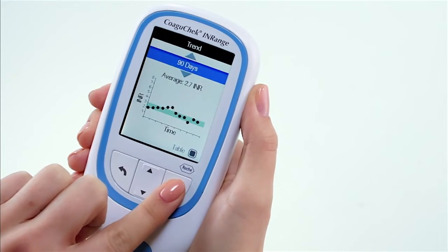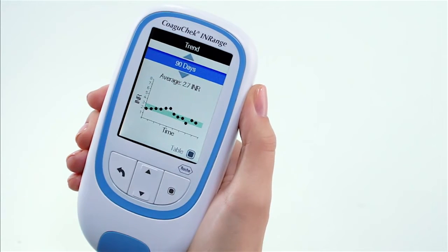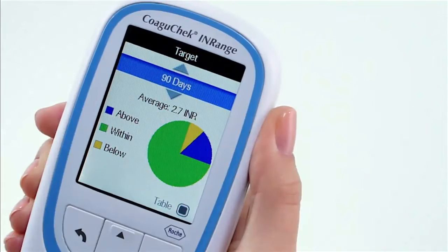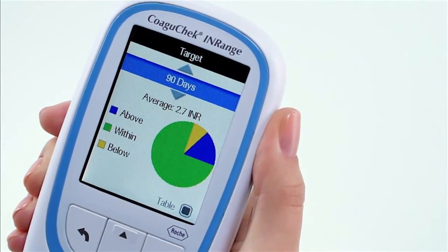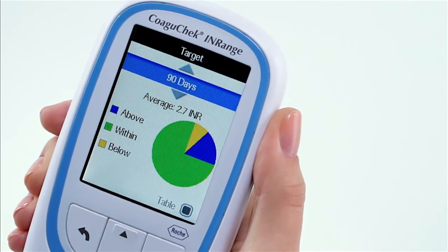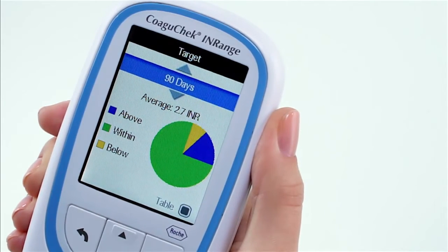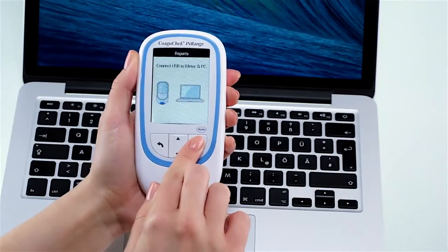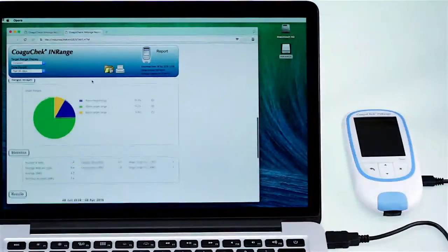Let's review the COAGUCHECK INRANGE and what it can do for you. The COAGUCHECK INRANGE enables you to track your time in range by graphically displaying how many times you have been within, above, or below your target therapeutic range. You can view your results on a PC by connecting your device via USB cable.